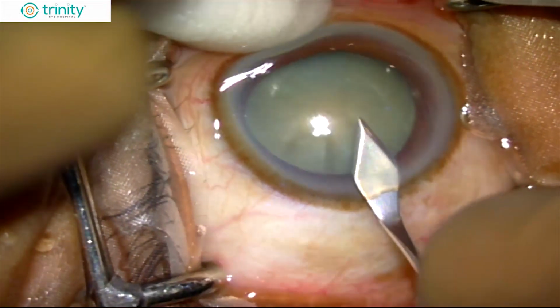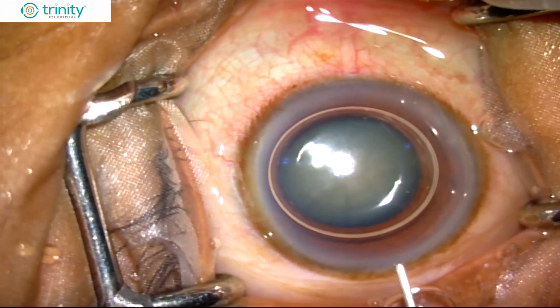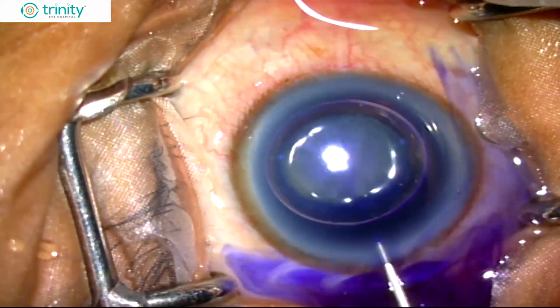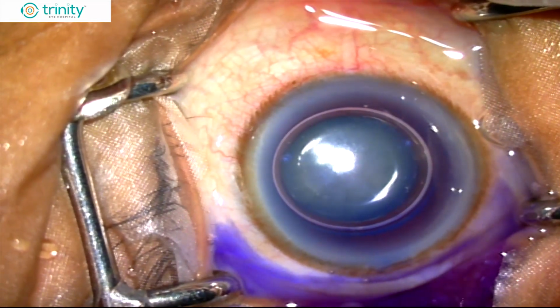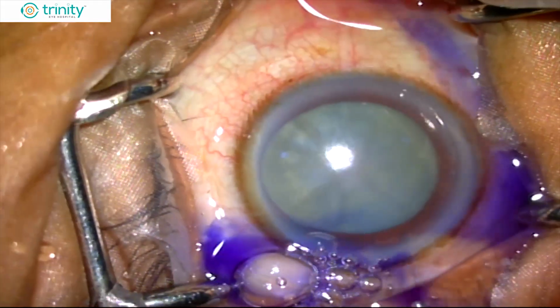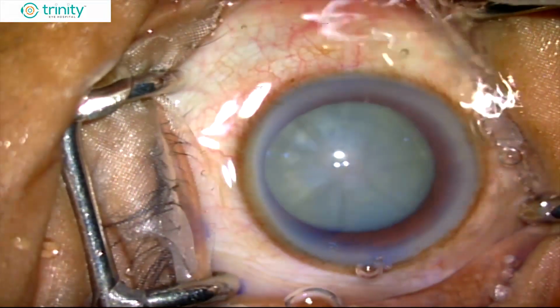Dear friends, in this video, I'm going to show you a case of hypermature cataract and how you can successfully manage the nucleus in such cases. So it's always preferable to do a staining of the capsule using trypan blue. This is to avoid undue complications during the rhexis, because the key point for a successful phaco surgery, as we all know, is a successful clear rhexis in such cases.